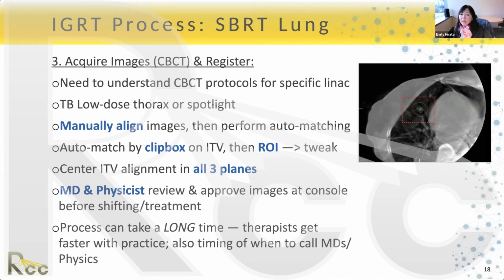So there's not a definitive answer that's going to apply for all cases. It's really case specific, and it really depends on the location of the tumor. But we do encounter situations where we will purposefully not align perfectly to the ITV because of these other constraints that exist. Yeah. Thank you.